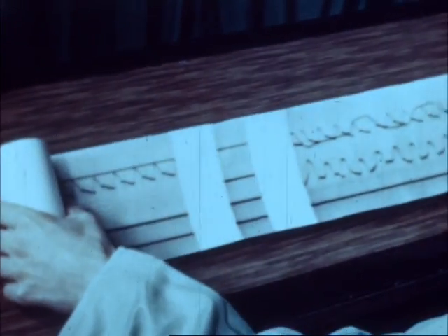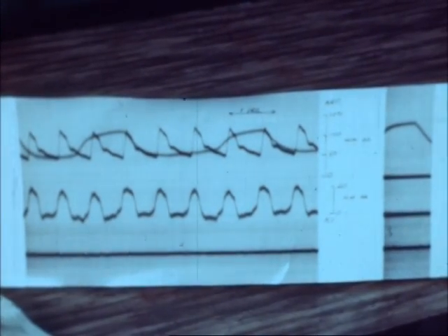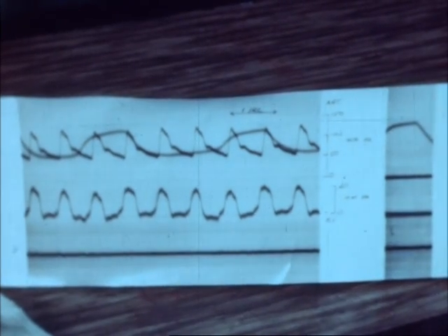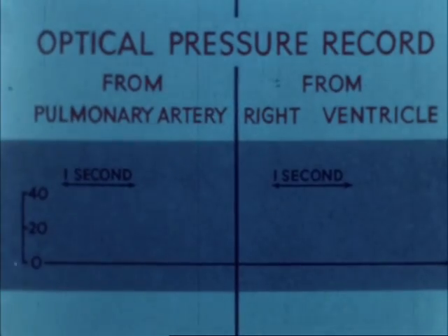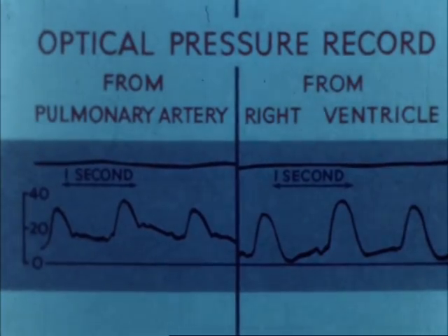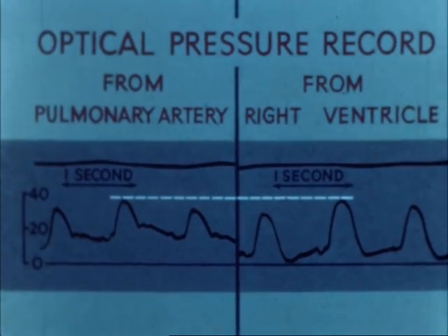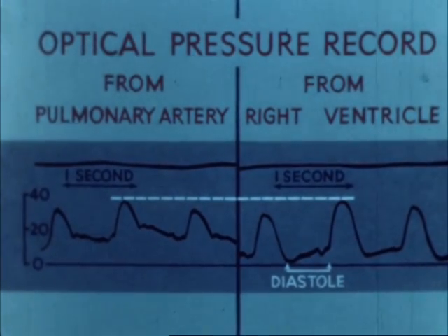Here is a developed photographic record showing from above down tracings of respiration, arterial pulse, and the lowermost record is the recording of pressures from the right ventricle, with the calibrated scale of pressures drawn alongside. The peak of pressure in the right ventricle is the same as the systolic pressure in the pulmonary artery. This record shows what happens when the catheter is drawn back from the pulmonary artery into the right ventricle. The dotted line shows the identity of systolic pressure levels, while the filling pressure of the ventricle is recorded at the end of diastole.